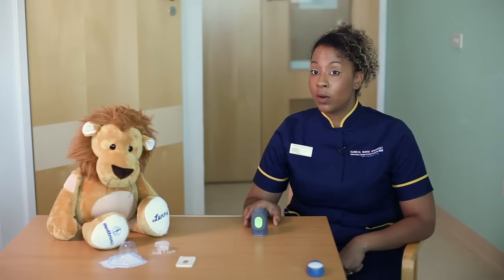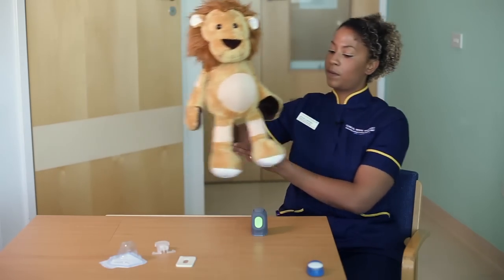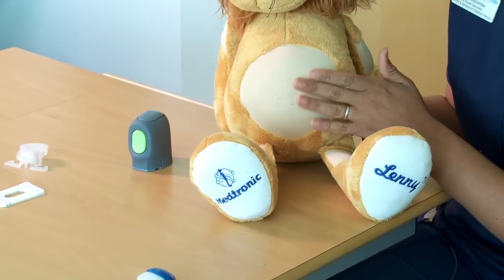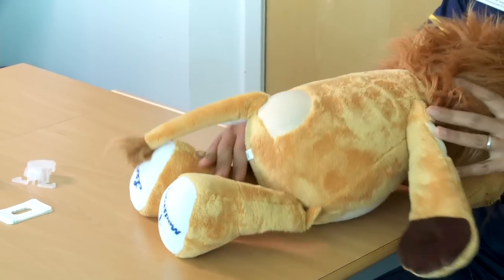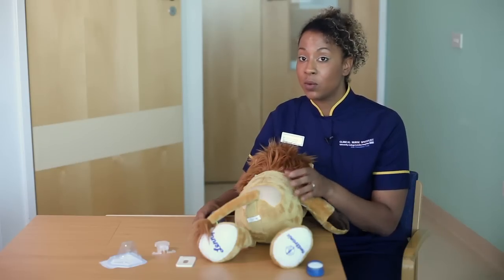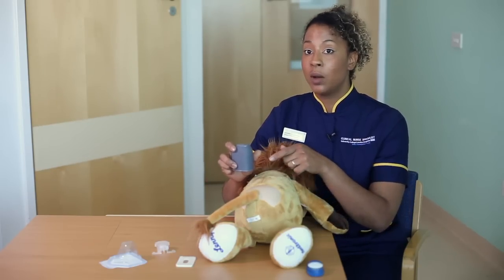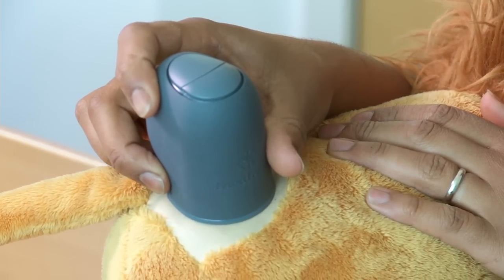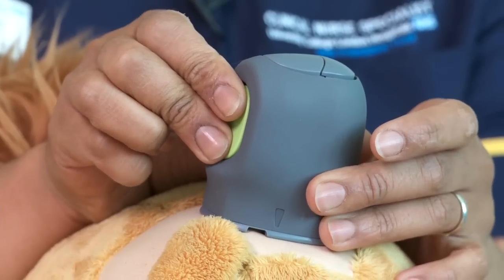We're all ready to go and to pop the sensor onto your child. The areas you can attach the sensor are the tummy, if there's enough fat, or the buttocks. At this point think about which way you want the Mini-Link to be facing once it's attached. The Mini-Link attaches to the round part and we normally recommend that it faces outwards. Place the sensor in the position you want and get ready to press the button.